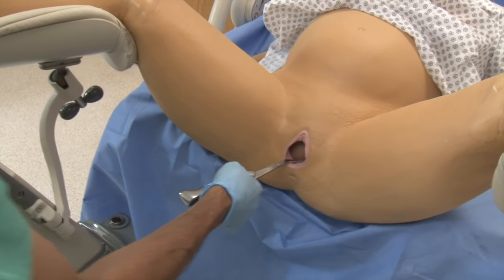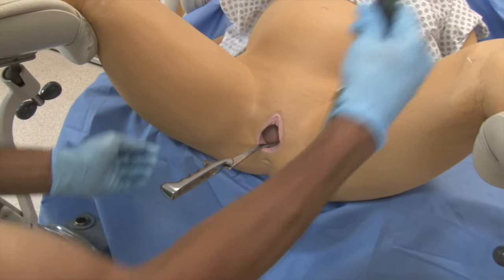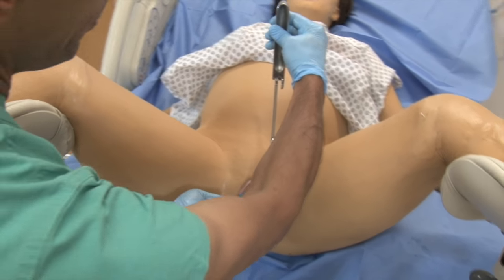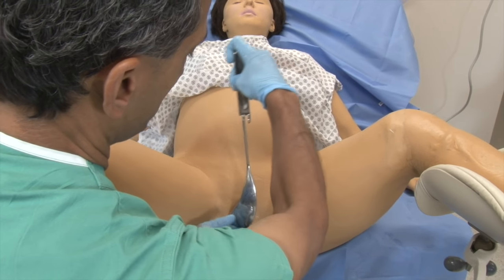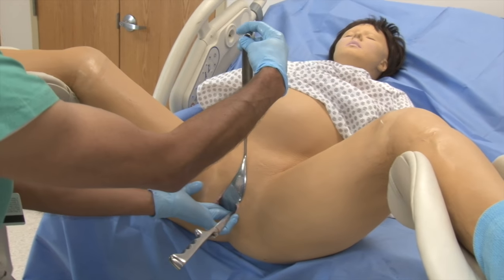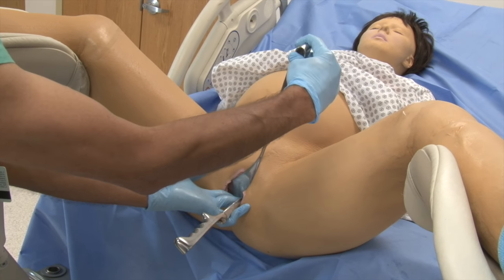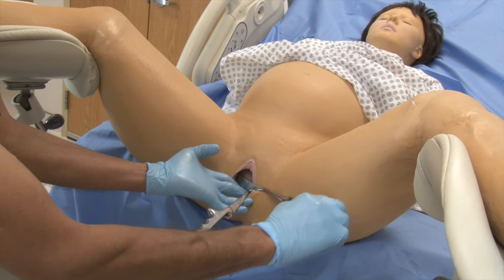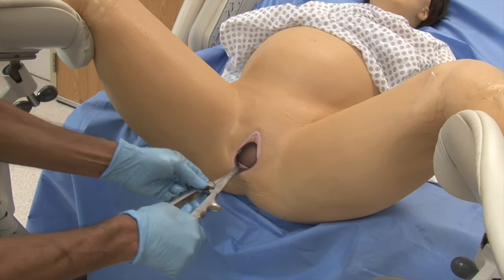The operator will hold that first blade and then apply the second blade opposite. The right hand is going to apply the blade on the patient's right side — straight upward, applying it on the fetal side by holding it directly and getting it onto the head, almost perpendicular to the table. My left hand is under the actual blade keeping it on the fetal head, rotating with my right hand against the thigh, and the blade then slips onto the baby's head.